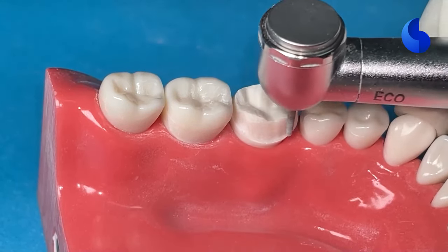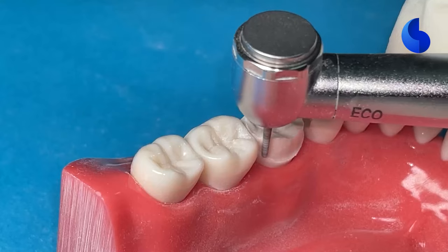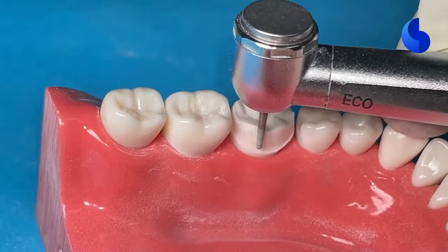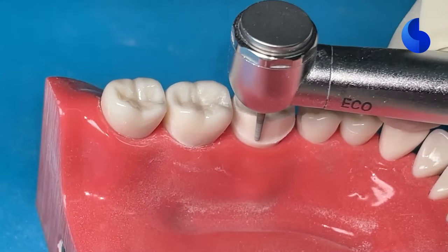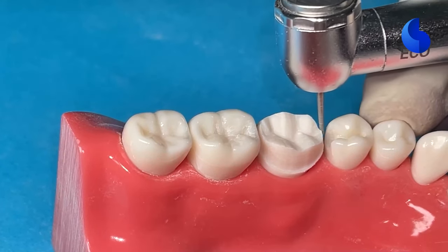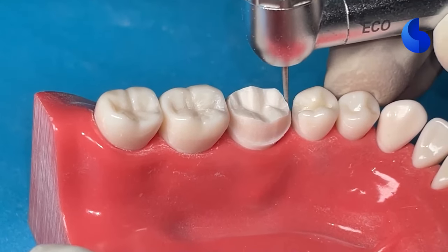Go ahead and smoothen all those lines out, the lines that you created when you replaced the depth orientation grooves, and create that beautiful taper so that you don't have any undercuts from your preparation when you look at the preparation from the occlusal surface. Now we'll move to our interproximal surface and use this larger diameter burr, our 856-016, to slowly move into this space and create that 1 millimeter margin on our proximal surfaces as well.